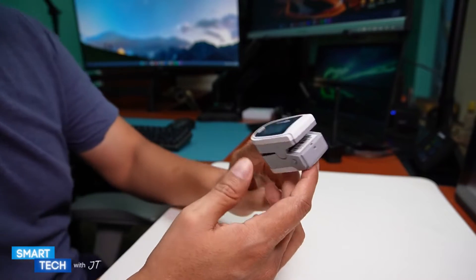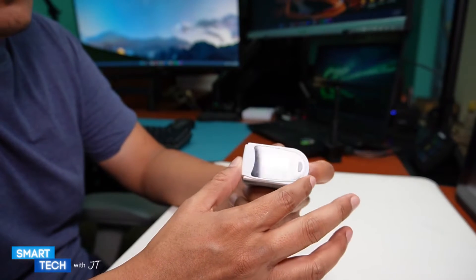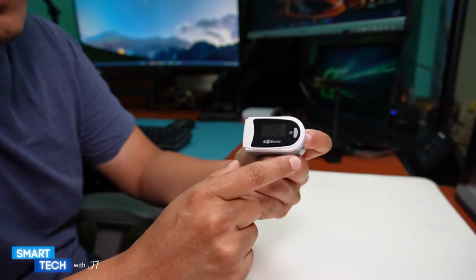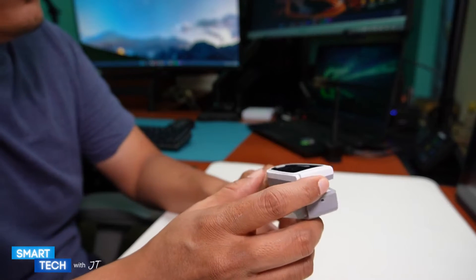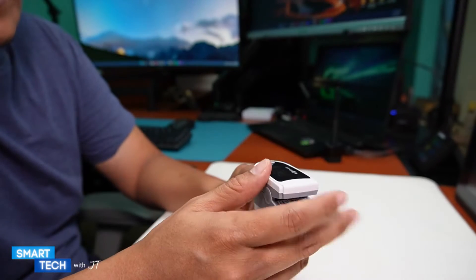Hello everybody, my name is JT and today I just want to do a quick update on the EMAI Oximeter. This is the EMAO80 version. I've been using this for about eight months now. I also have another version by EMAI which is the Sleep O2 version — I actually upgraded to that one.